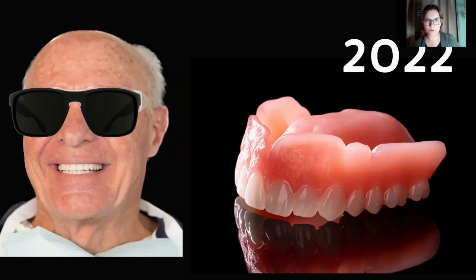And so anything you put in the software, the printer can create. And that's not always the case with milling because we're limited by the size of the mill and the size of the burr and the position of the burr in the mill. So a mill can't recreate all these really precise undercuts and this really small anatomy the same way that a 3D printer can. A 3D printer can print anything, no matter what the geometry is.